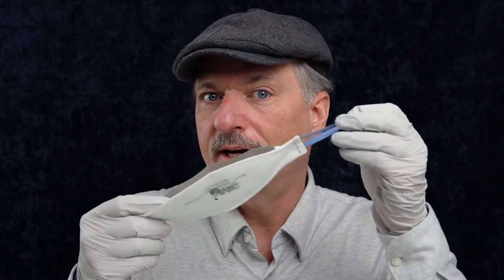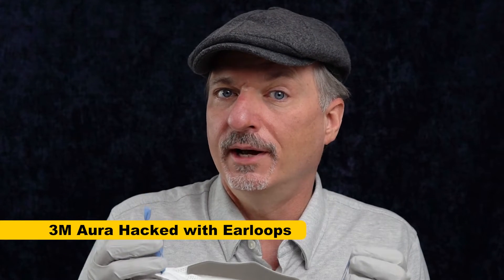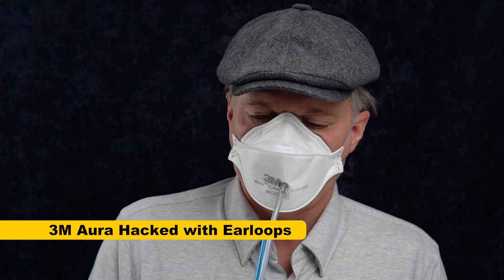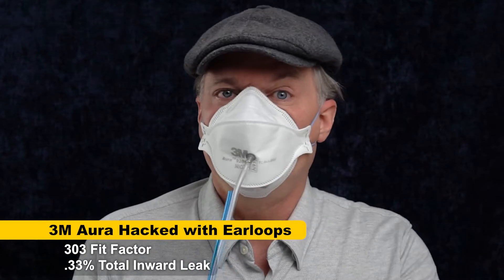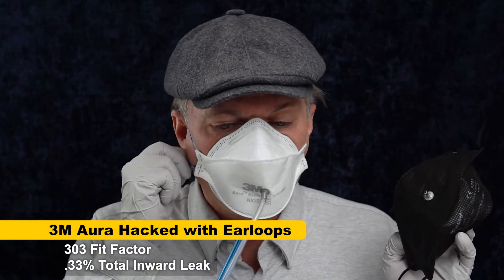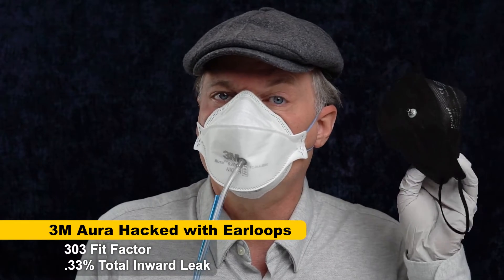Now we're going to compare this to the 3M Aura, but we're going to do a special comparison. To be fair, I'm going to compare the Hard FFP2 mask to a 3M Aura where I have cut the headbands in half and tied them into ear loops. So that's going to compare an ear-loop mask to an ear-loop mask. The result was 303 — that means this mask is way better than the Hard FFP2 mask even though they both use ear loops. 303 means there's a total inward leakage of about one-third of one percent, as opposed to 10% leakage with the Hard mask.